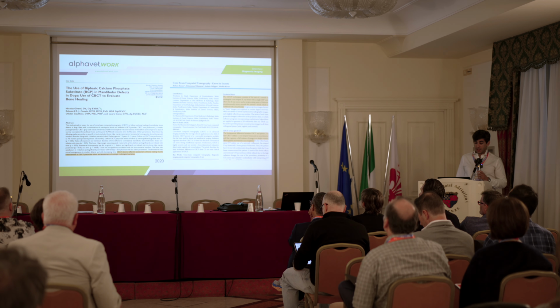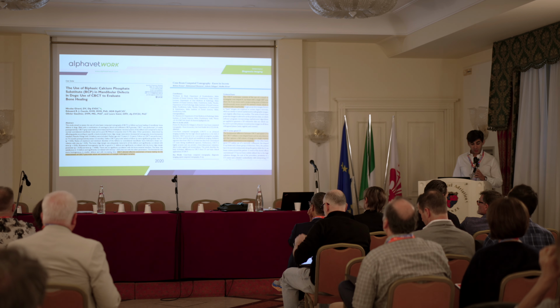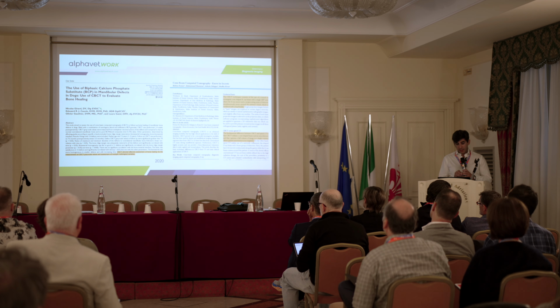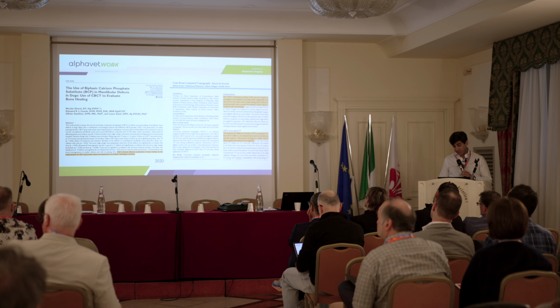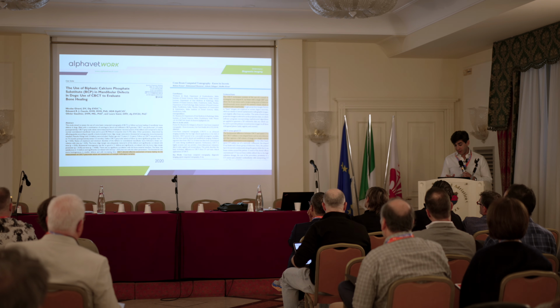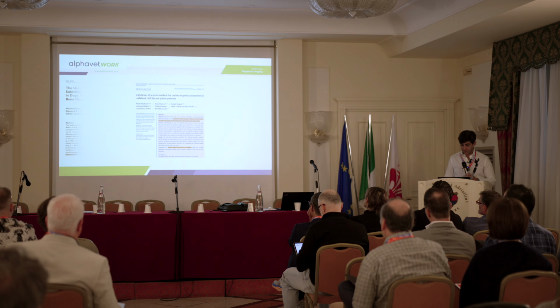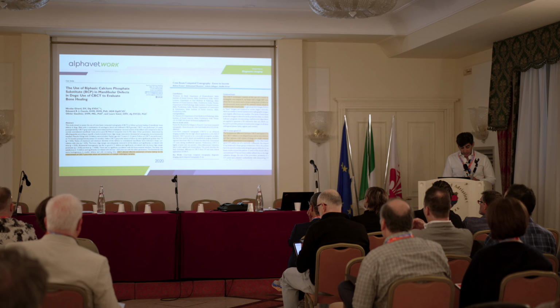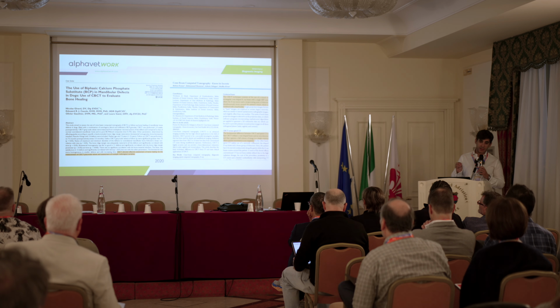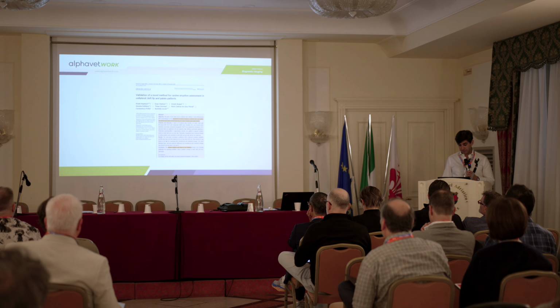In 2020, there was the biphasic calcium phosphate in mandibular defects in dogs, so the use of CBCT to evaluate the bone healing. And also, it shows its secrets, how the cone beam CTs work. So the fundamental difference between CBCT and spiral CT is that CBCT utilizes a cone beam shape, so the area of the detector captures a full volume of image in a single rotation. And also it is an effective assessment of bone healing. So these are two very important things that we have to reach in every daily routine.